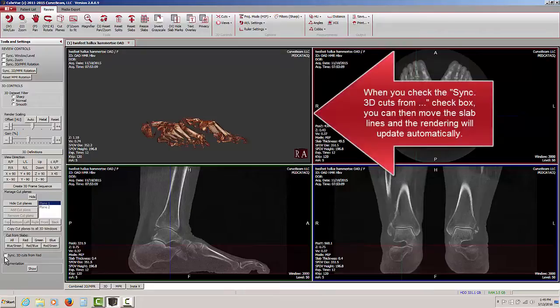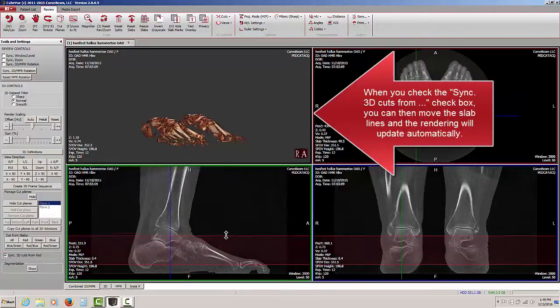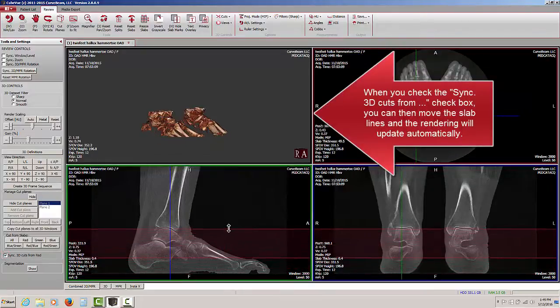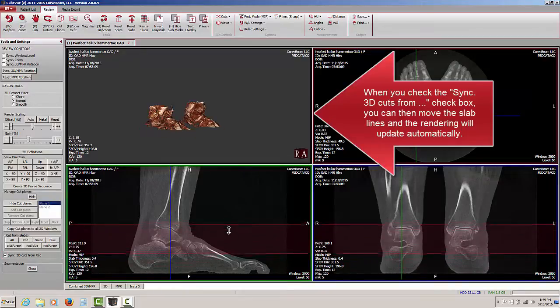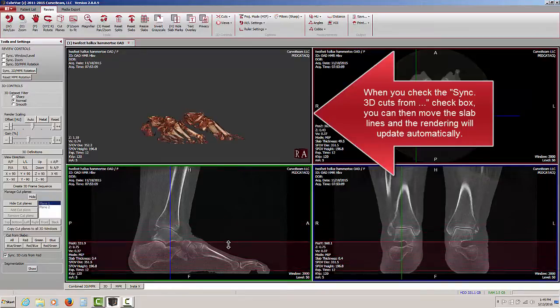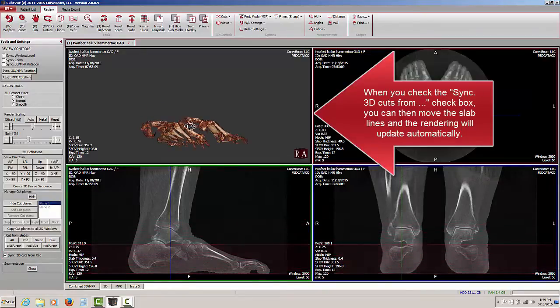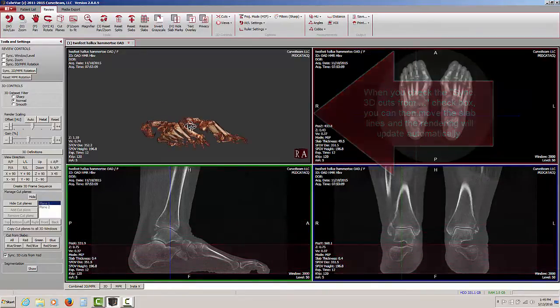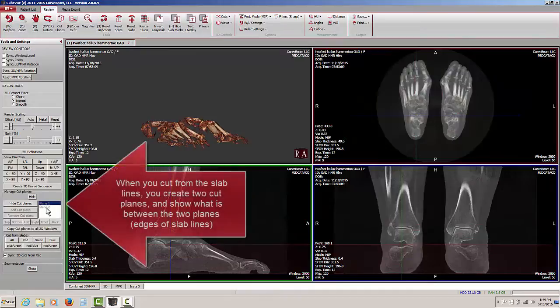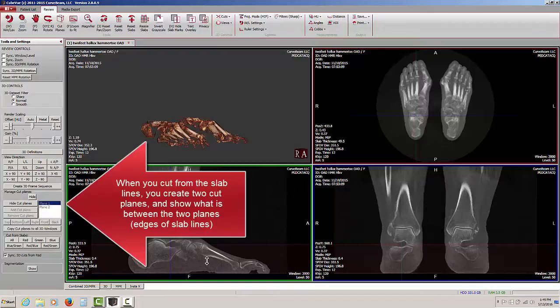Furthermore, if I move the slab lines by checking the synchronize box, I can also have the 3D rendering adjust its cuts at the same time. Notice we have plane 1 and plane 2. We actually have an upper and a lower cut plane, and we are showing you everything that is between the two edges.